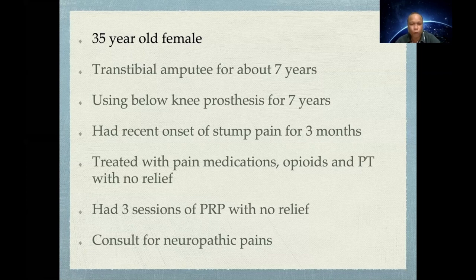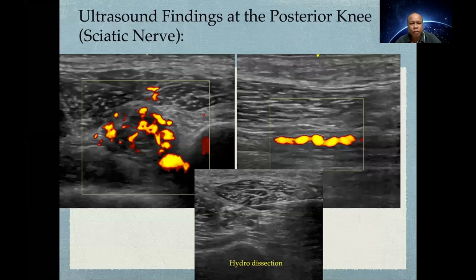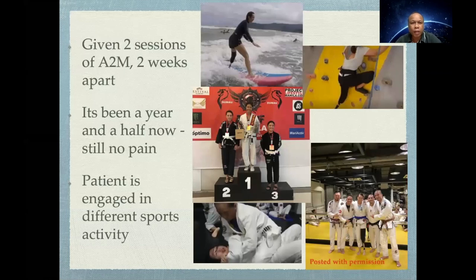So we tried, this is the patient with amputation. So these are the ultrasound findings. You can see here neovascularization, very painful. That's a neuroma of the sciatic nerve. So here, after giving 2 sessions of A2M, 2 weeks apart, and it's been more than 2 years now since I first saw her, she is now engaged in so many sports activities with no pain at all.